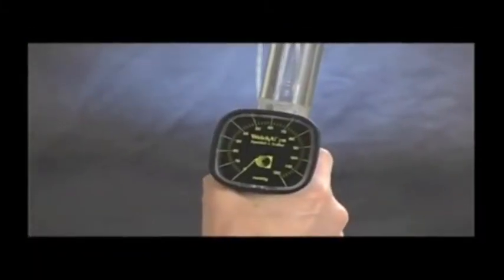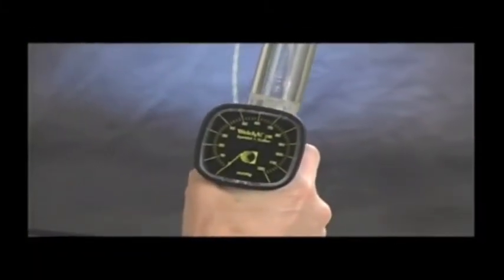The message will read, "Hold pressure sensors low and press check." Ensure that the pressure gauge on the calibrator reads 0. Then, click on the check mark icon located in the bottom left of the screen. Once pressed, the system reads the low calibration level for 5 seconds. Next, the text instruction near the top of the screen will read, "Hold pressure sensors high and press check."